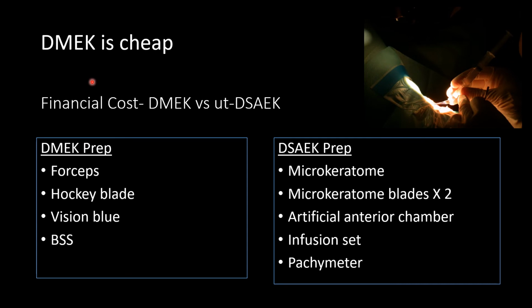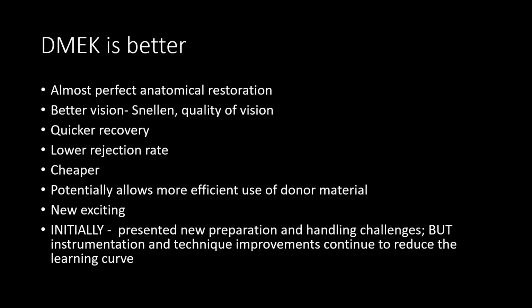However, please don't worry that it's going to be quite costly doing a DMEK procedure, because doing a DMEK is cheap. The equipment that you need is simple and very easily obtainable. So going back to our original question of why we should be performing a DMEK procedure instead, well, the simple answer is a DMEK procedure is better.